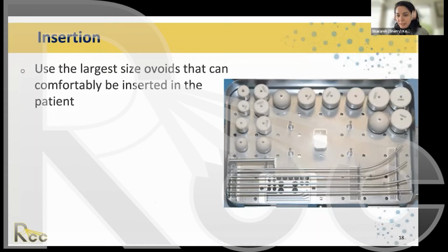And Abigail from Ghana is asking, would an image-guided applicator insertion help mitigate these insertion mistakes? Which imaging modalities would you suggest? Yeah, that's such a great question. The answer is definitely yes. It's a big endeavor to have either CT guided or MR guided insertion, but yes, it would help tremendously. One thing that we use a lot, and many of us would have this in our clinics already, is ultrasound imaging. Our radiation oncologists will often do transabdominal ultrasound imaging, live imaging, while they're doing the insertion.